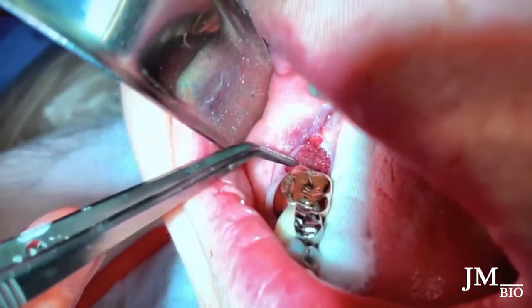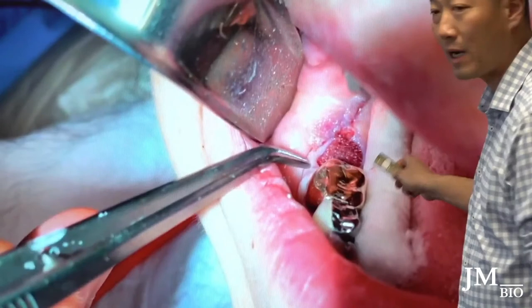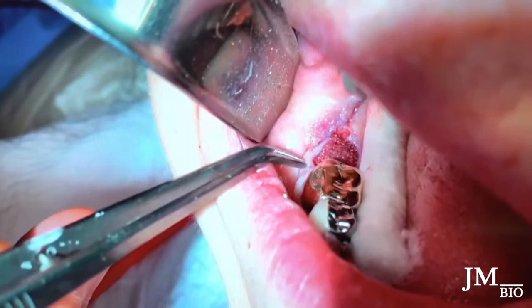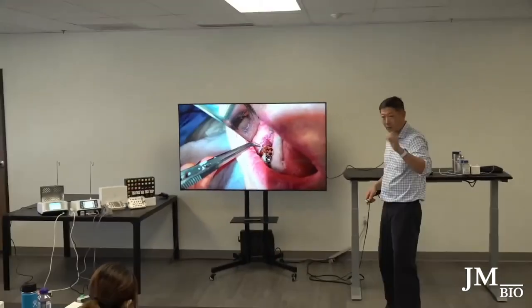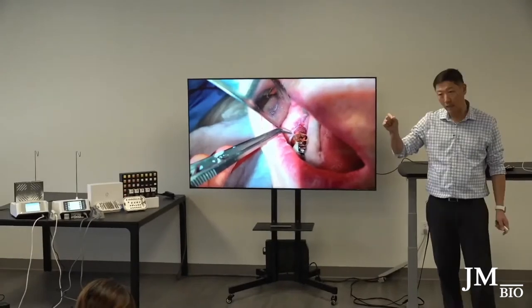It's temporary, but you've got to tell the patients. You don't want to get too much on there because it's going to flow everywhere — that's why I have the cotton back there. I keep cotton in place to make sure it doesn't go anywhere. Tell the patient they'll notice plastic things kind of chipping off. They sell pipettes you can use to apply it.